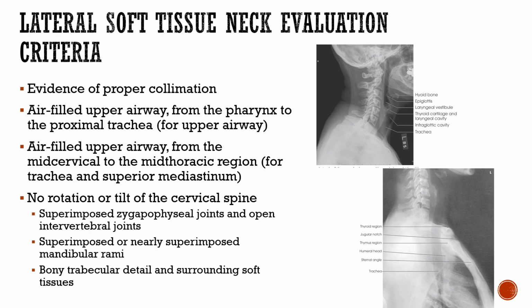Now looking at the two images, this one's the upper airway at the very top and the lower airway at the bottom. So we're looking at the two different possible images, and we're looking for no tilt or rotation of the cervical spine.